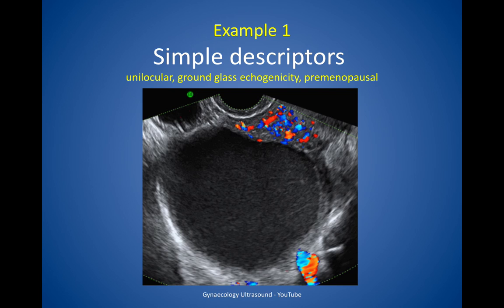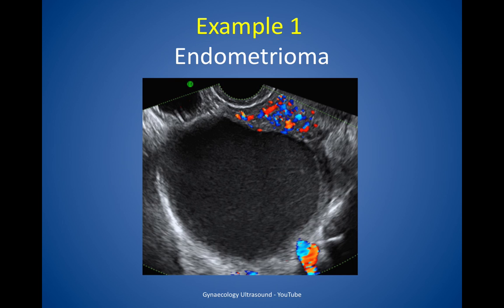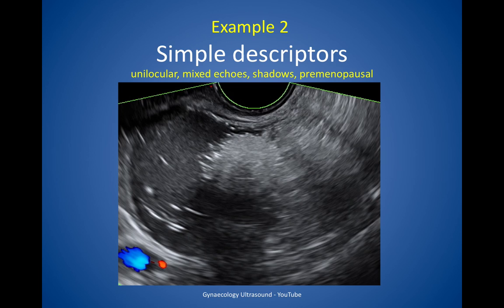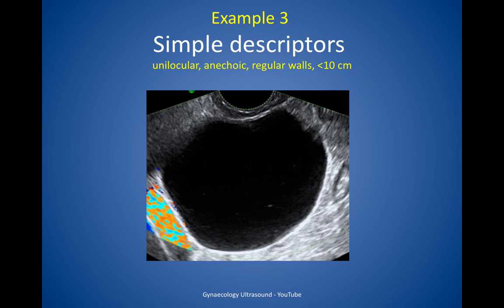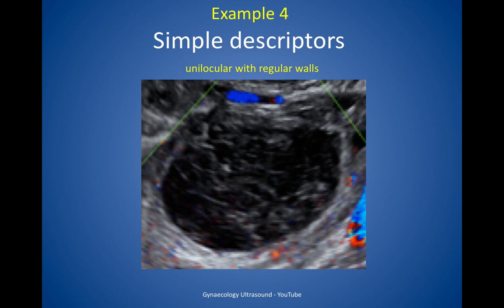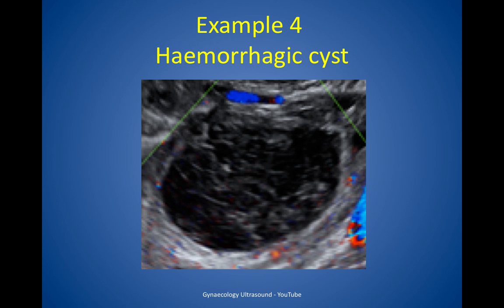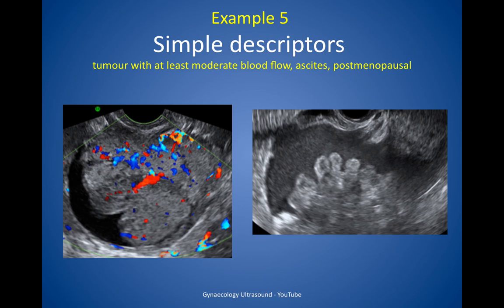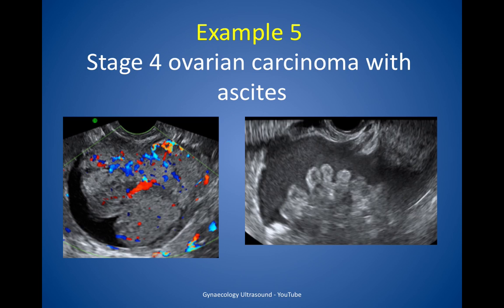In this first example, this is a unilocular cyst with ground glass echogenicity in a pre-menopausal woman — on simple descriptors this is an endometrioma. This mass is unilocular with mixed echogenicity and shadowing in a pre-menopausal woman — on simple descriptors this is a dermoid. This mass is unilocular anechoic with regular walls less than 10cm — on simple descriptors this was a serous cyst adenoma. This cyst is unilocular with regular walls — it was a hemorrhagic cyst. This is a tumour with at least moderate blood flow, ascites in a post-menopausal woman — on simple descriptors this was ovarian carcinoma.